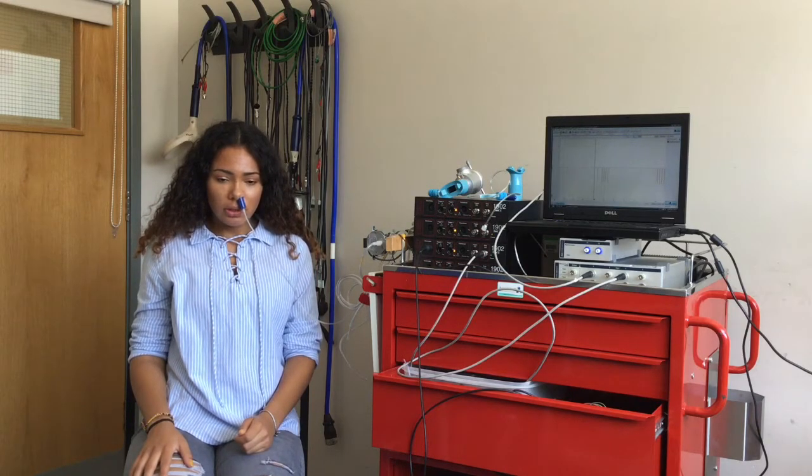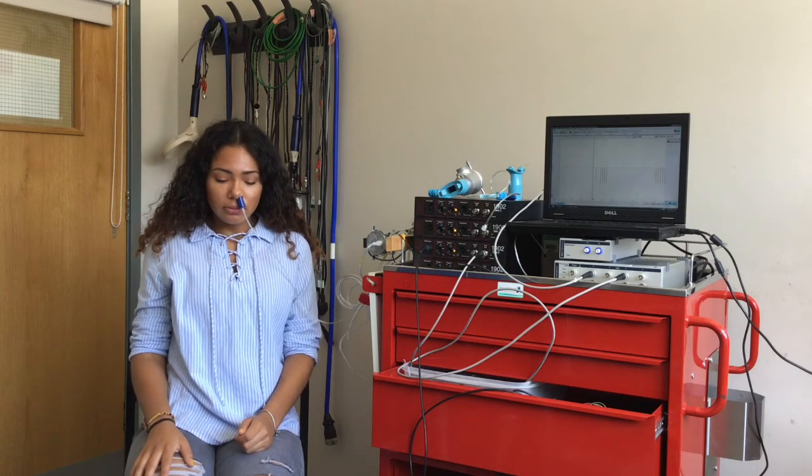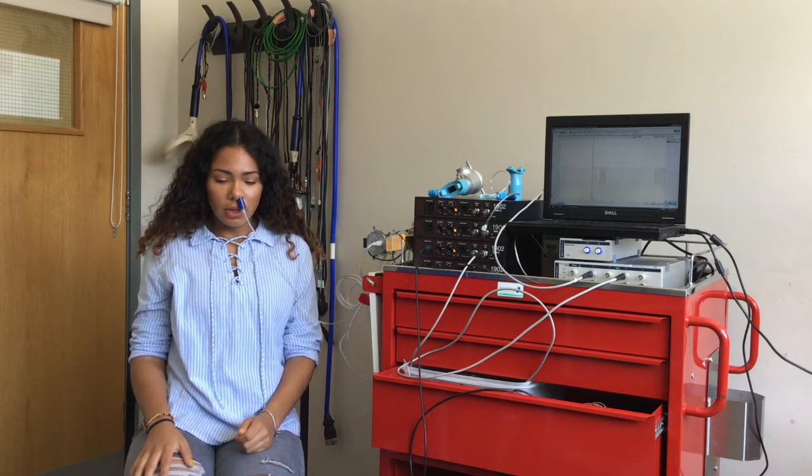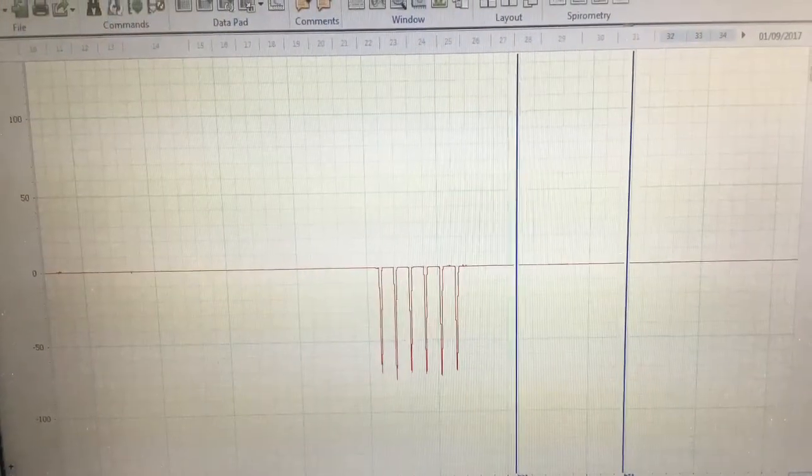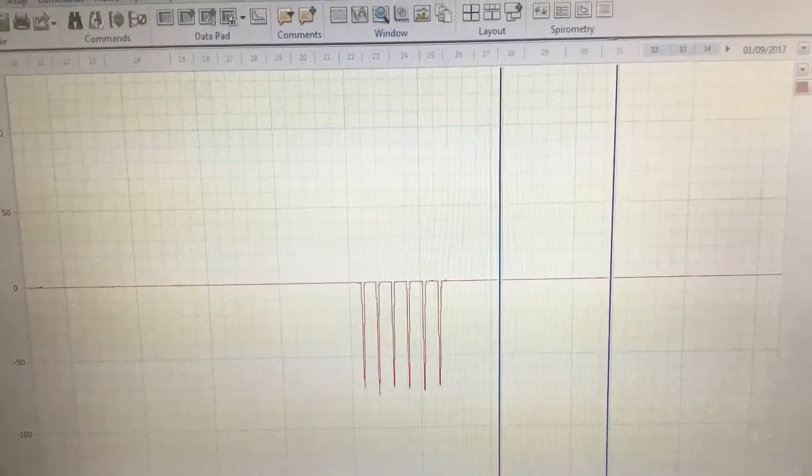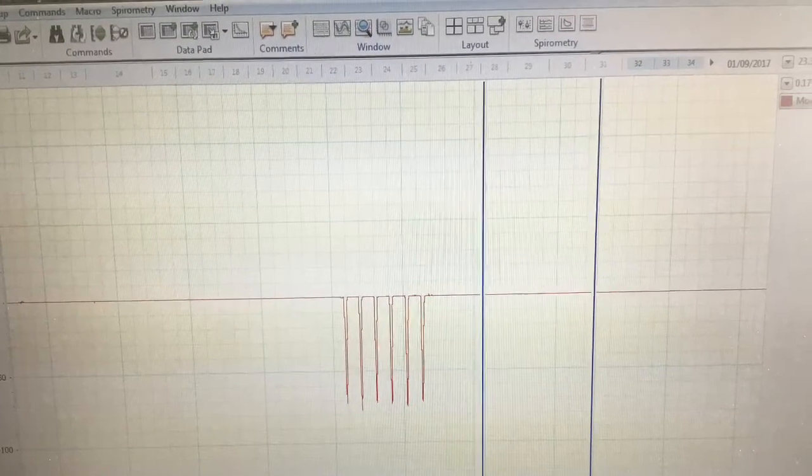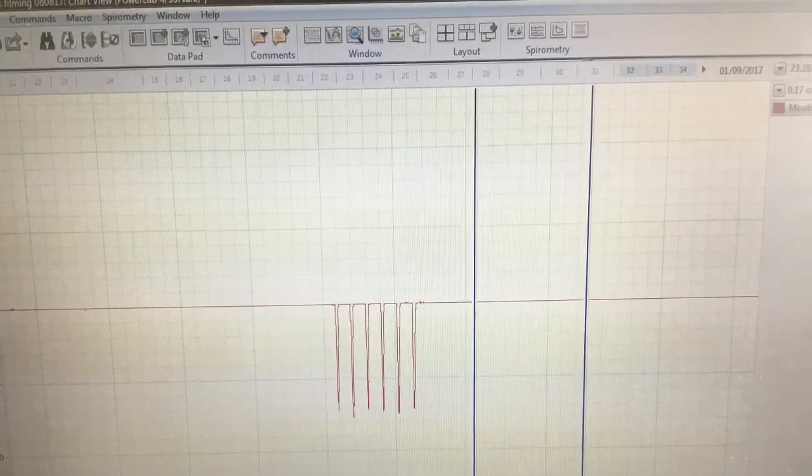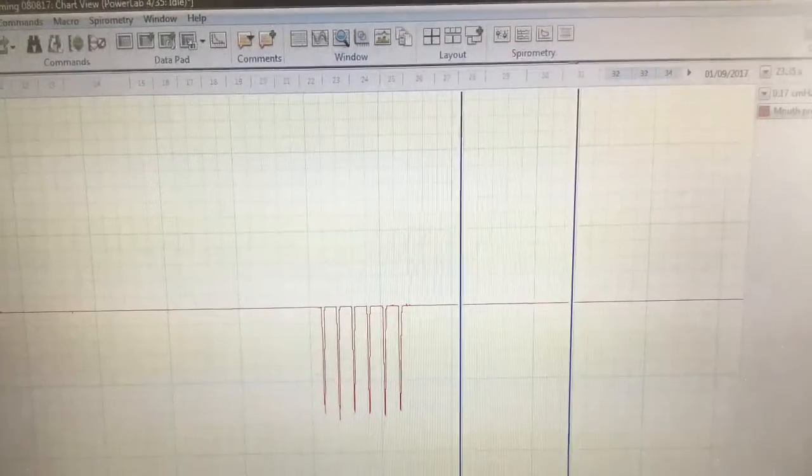The patient performs a series of short, sharp sniffs until a consistent value has been obtained. Three similar readings within 10% of each other must be recorded. Each individual sniff provides an indication of overall inspiratory muscle strength.